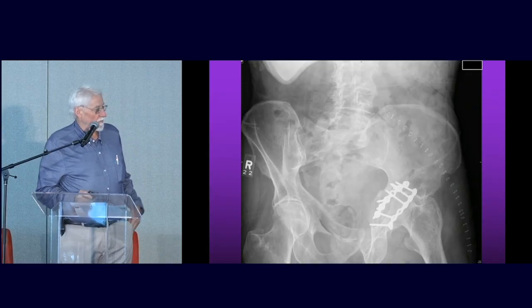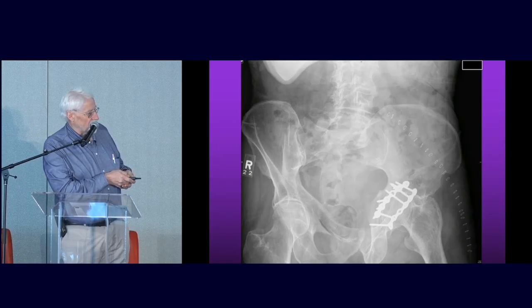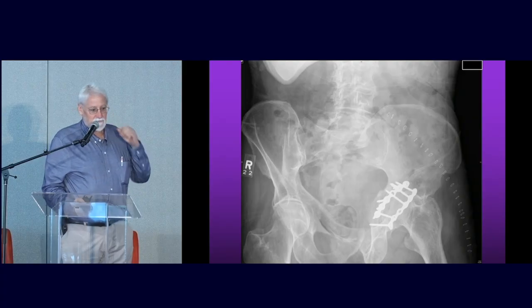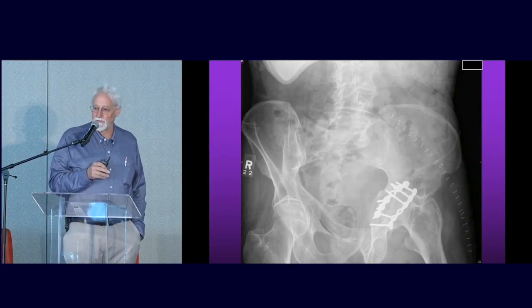Yeah. So I think you're agreeing now with me, Joe, if I'm not incorrect. You can see that this head is subluxed, and so it's not going to go well with the dome of it. So that's why I would do it. But I'm curious because, you know, Joe.